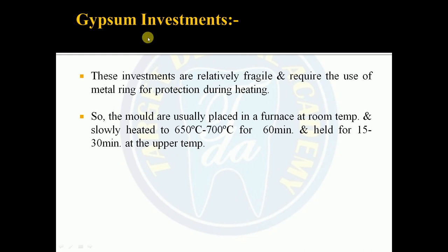Coming on to gypsum investment, these investments are relatively fragile and require the use of a metal ring for protection during heating. In this, the molds are usually placed in the furnace at room temperature and slowly heated to a temperature between 650 to 700 degrees Celsius over 60 minutes and held for 15 to 30 minutes at the upper temperature. Very important point.